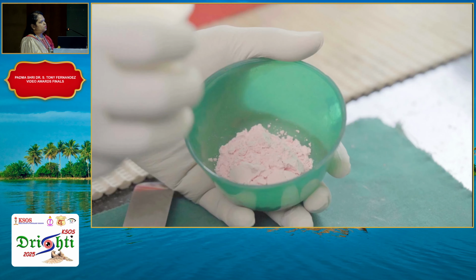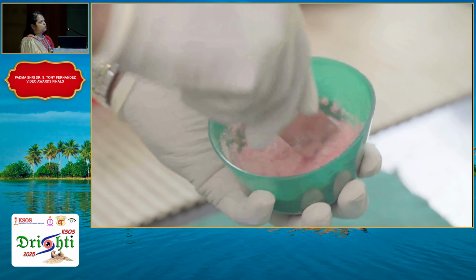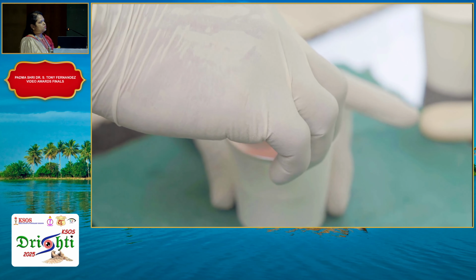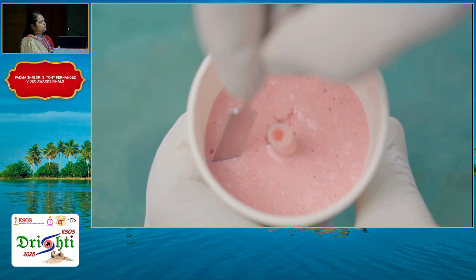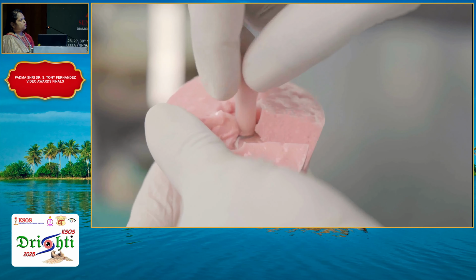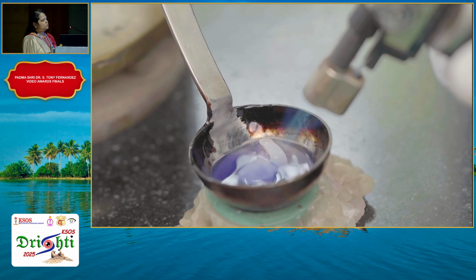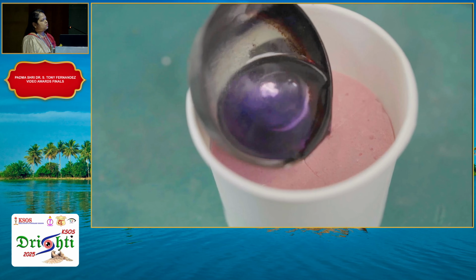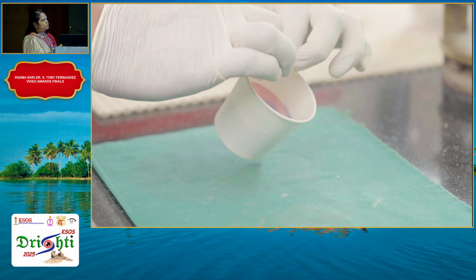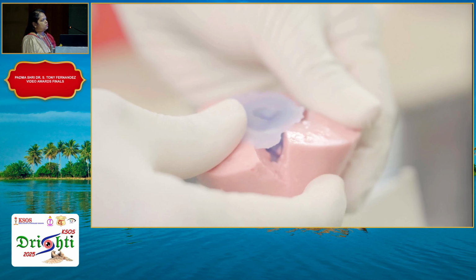A plastic tumbler is half filled with water and alginate is taken and made into a paste. The impression tray is immersed into this paste and allowed to set. Once it is set, the contents are taken out into two halves and the tray is removed. In a wax ladle, carving wax is heated and poured into the hollow space left by the original tray and allowed to set. After 15 minutes, the halves of the alginate are opened and the set wax is taken out to form the wax mold.